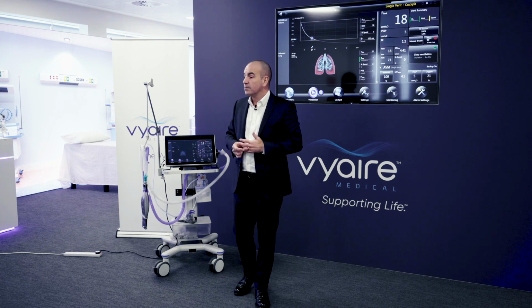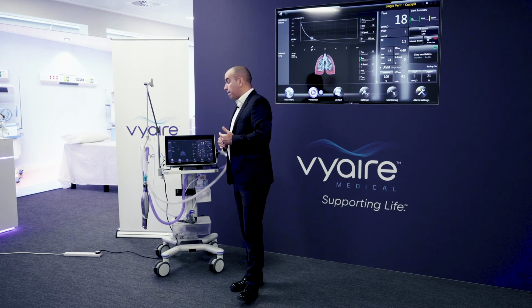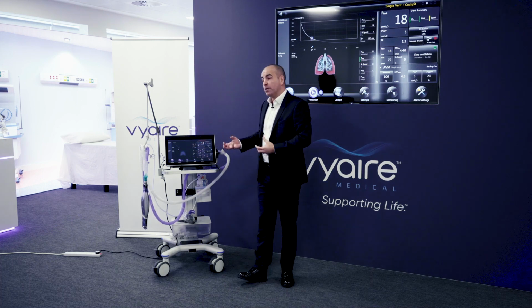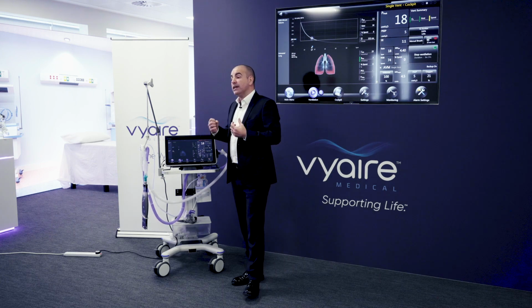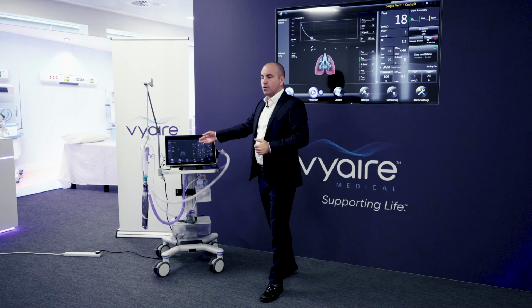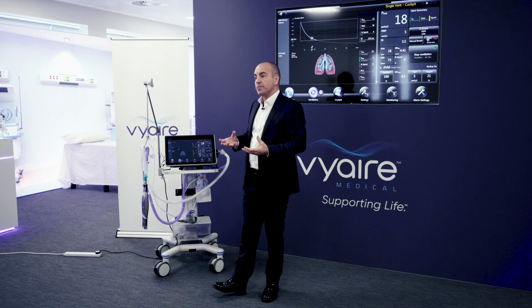You said that the market is very competitive. Yes, it is. What are the unique selling points with this? So all ventilators put a breath in and let the breath out. They all do that. What we've done is made it very configurable and tailored to how the clinician wants to use the device. In addition, we've added features such as the animated lung, the vent summary, the auto sync, the auto rise, all these features that we've put into the box to make it as efficient as possible.